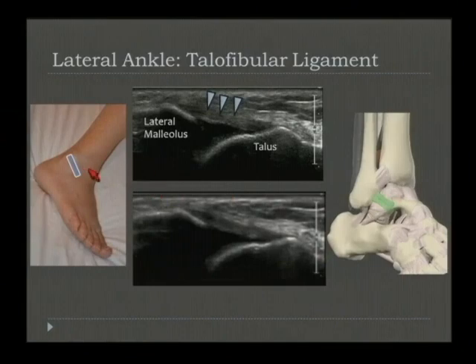Well, once you are on the lateral side, you keep your transducer right on that lateral malleolus. And in order to look at the talofibular ligament, you will now get the medial aspect of your transducer and aim it slightly inferiorly to go along the course of the anterior talofibular ligament as outlined here. It's easy to discern between these two ligaments given the differences in obliquity, given that the tibiofibular courses superiorly and the talofibular courses inferiorly. It's easy to actually identify them as separate structures.